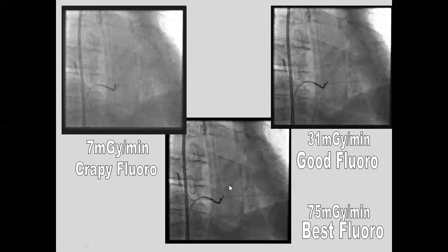And then our best fluoro, this is what the cath lab was using. This is at 15 frames. This is what the cath lab was using as their default for years. I've got them to switch down to this one, the 7.5 frames. So you can see, like I said, it halves the dose. So very important to look at.